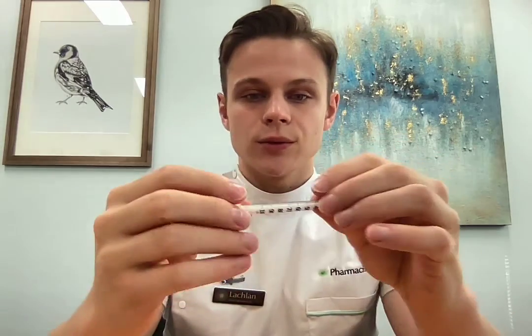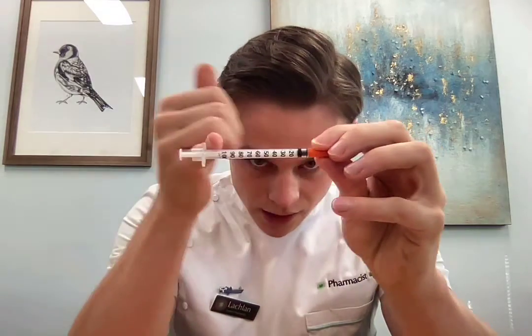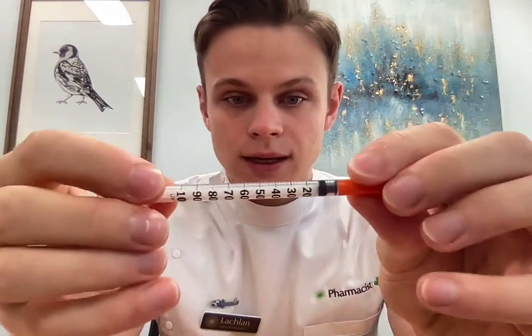The needles that we use are insulin needles. The full volume is one mil and that's broken up into 100 units. So as you can see, there's 10 units, 20, 30, 40, all the way up to 100.